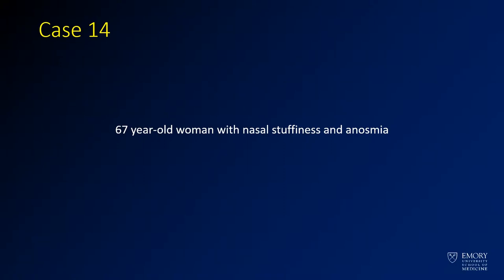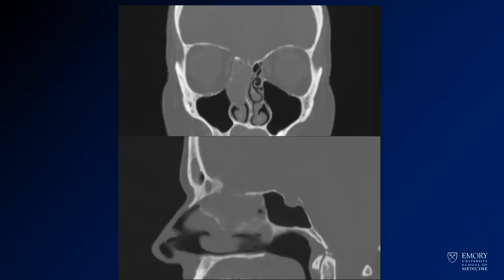Case 14 is a 67-year-old woman with nasal stuffiness and anosmia, or inability to smell. You have coronal and sagittal images from a CT.